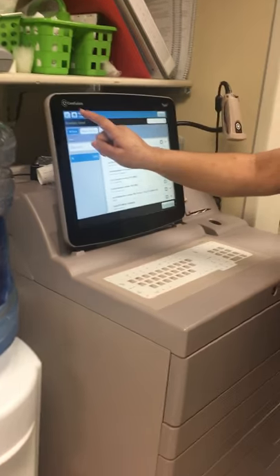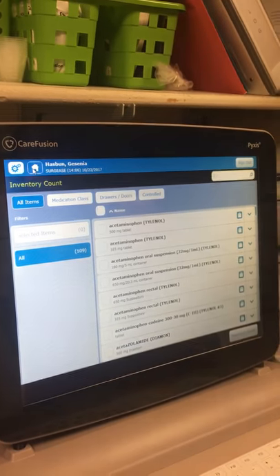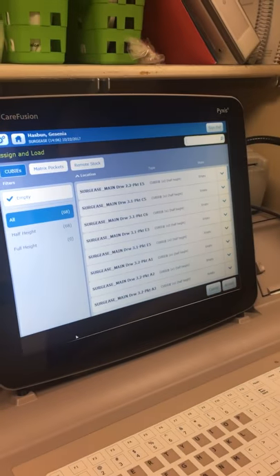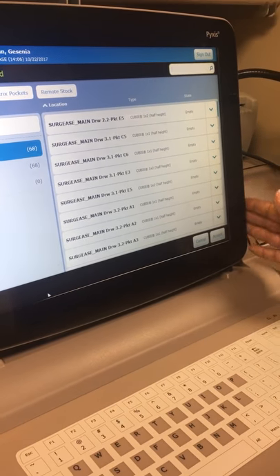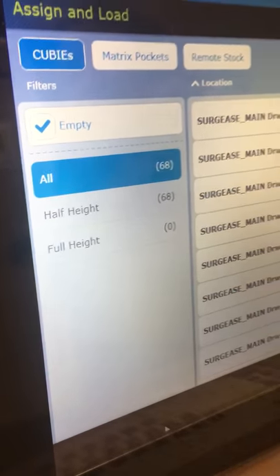We'll hit the home button to go back. Up here we have settings and home. From this menu, our pharmacy staff personnel can load new medications. They have the options of loading by half heights, full heights, and we have our matrix drawers.